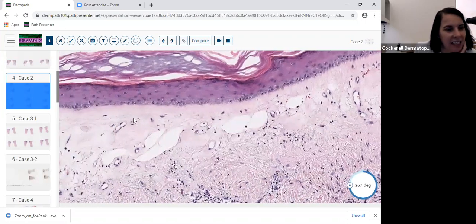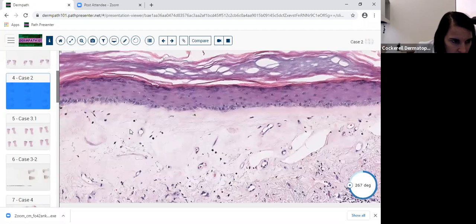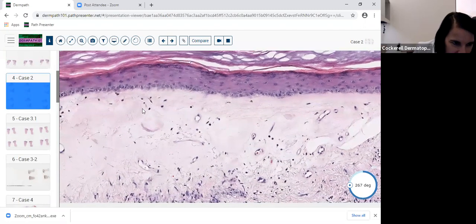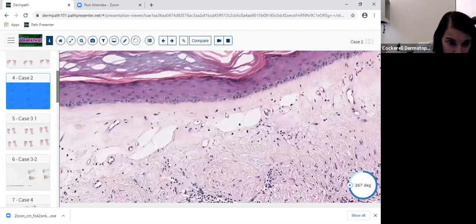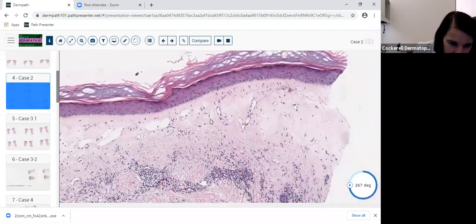You're also seeing not so many melanocytes here, which may explain the clinical appearance of this porcelain white lesion that can be plaque-like on the genital area, as an example. It can also be in other parts of the body, can also be in children and adults. But you're seeing a decrease in melanocytes. You'll see a couple of melanocytes in here, but the reti are wiped out and the melanocytes are decreased and the melanin is decreased. So that's why you're getting this clinical appearance.